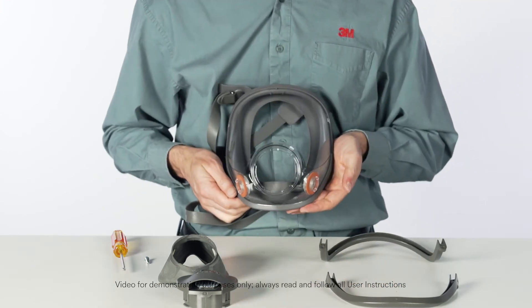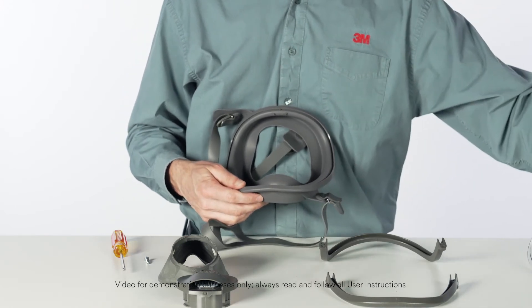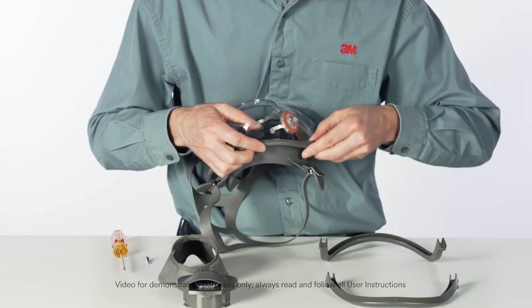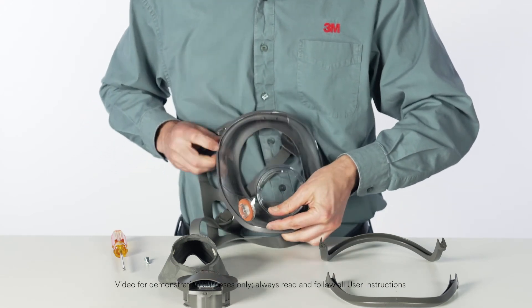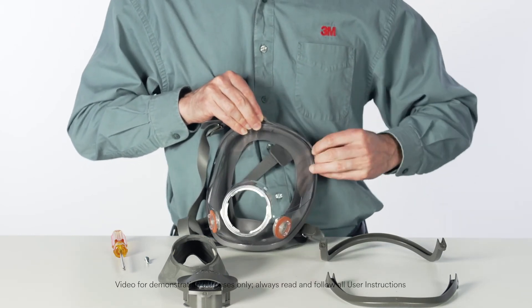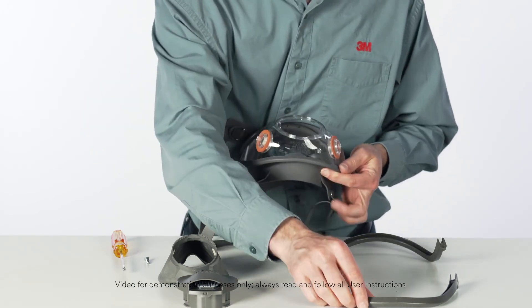Pull the frame top and frame bottom away from the face seal. Remove the face seal from the lens. Place the new lens and face seal together, aligning the marks at top and bottom. Position the top and bottom frame, aligning the marks at top and bottom.